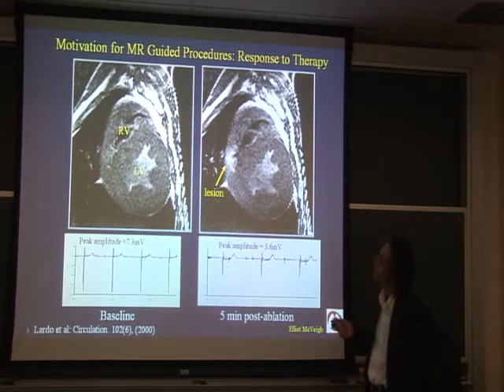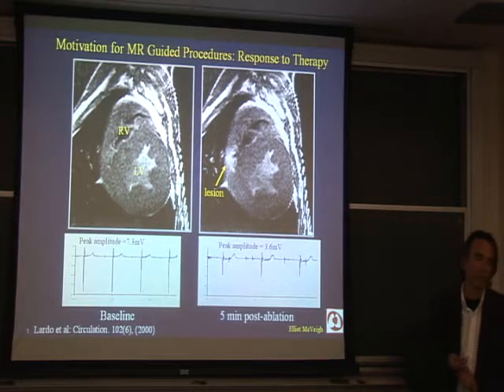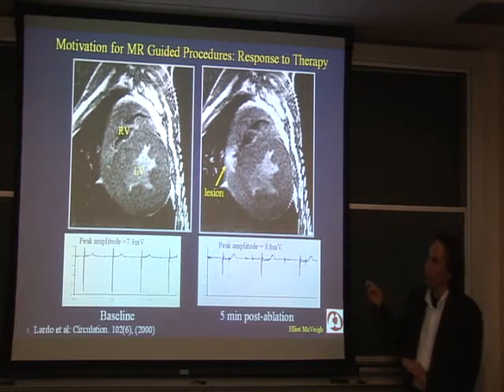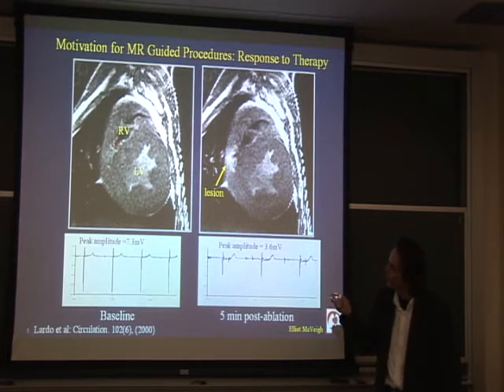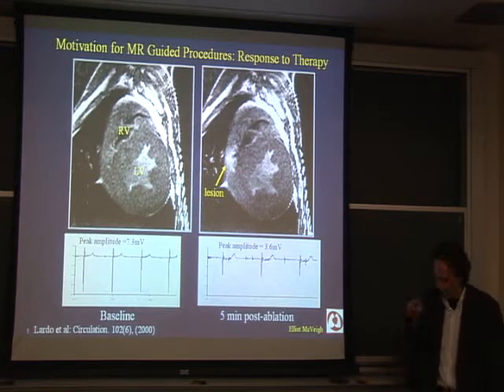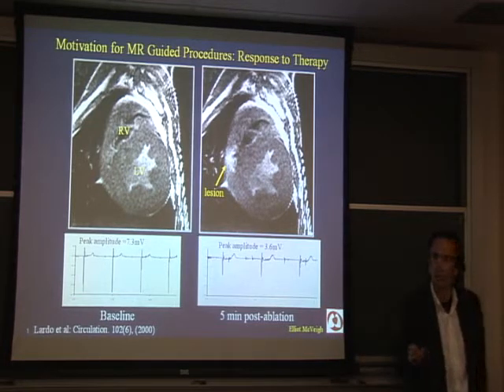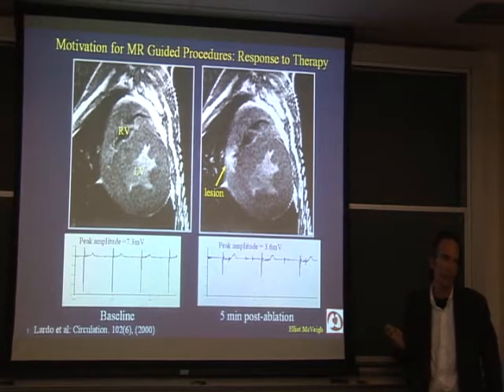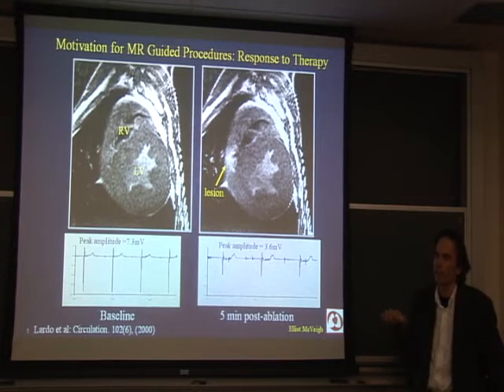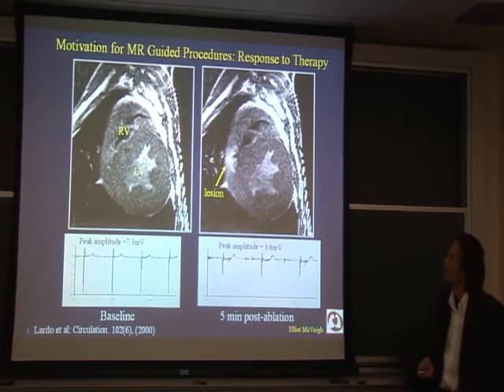As an example, in electrophysiology, if you're trying to ablate tissue with radio frequency energy, you can place a catheter, which is essentially an RF antenna, and there's an ablation catheter right here in the front of the right ventricle. With that catheter, you can pulse radio frequency energy, say at 50 watts for 30 seconds, and that will heat up the tissue around the catheter and destroy that tissue. So if there's ectopy generated from that tissue, it will eliminate that ectopy or block waves of activation.